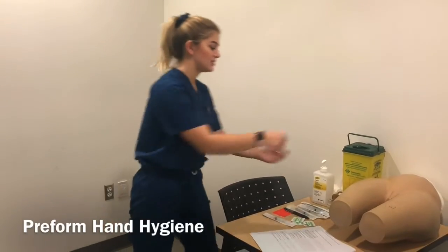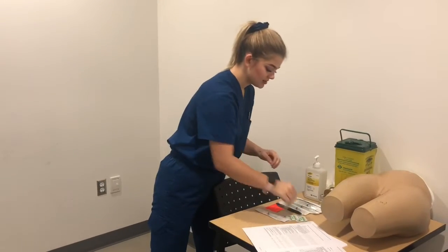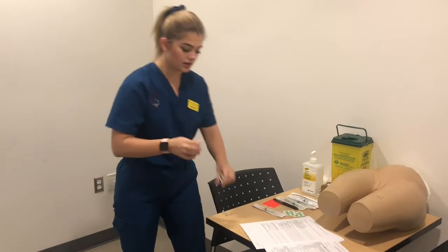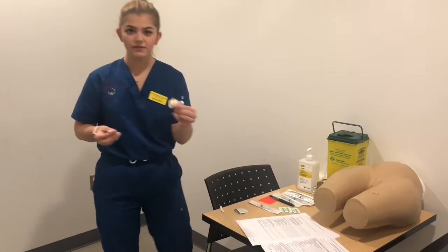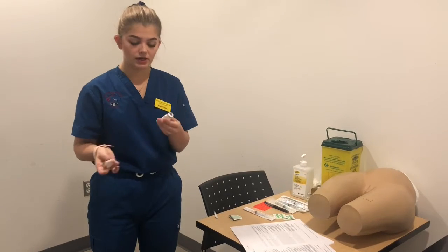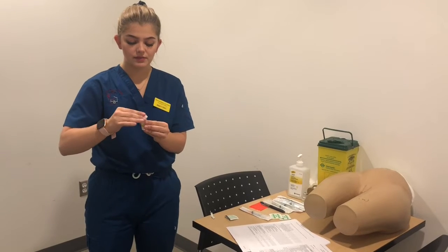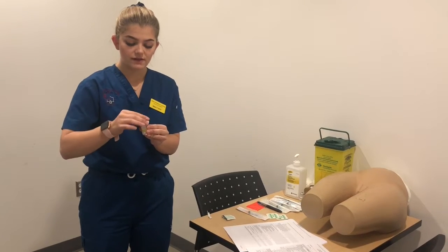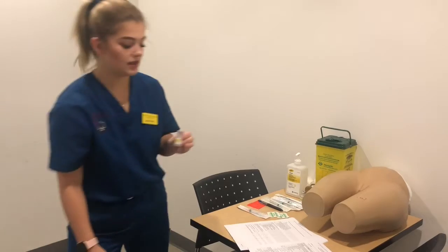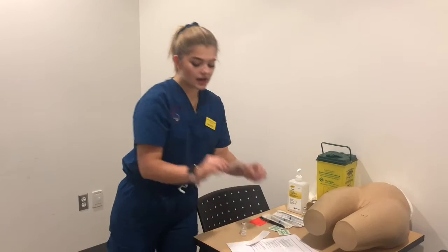Okay, so I'm just going to perform some hand hygiene before I draw up the medication. I'm going to take an alcohol swab, and with it, I'm going to pick up the vial, ensure it's the right medication and the right dosage on here, because some heparins can have a higher dosage. And then you want to clean the top of the vial with the alcohol swab. Dispose of it properly.